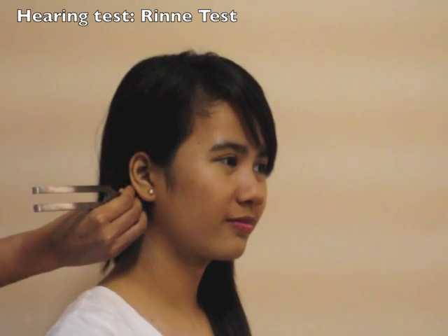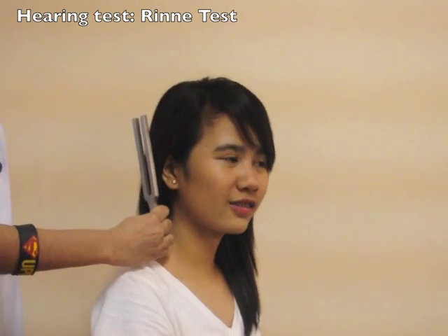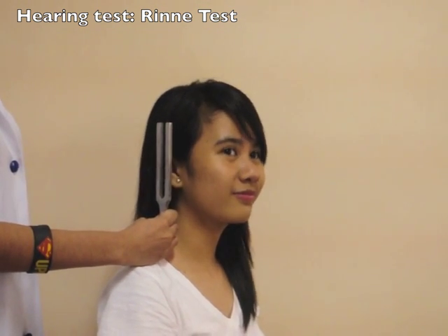Count the time until the patient can no longer hear the sound. Immediately bring the tuning fork in front of the ear. Continue to note the length of time until the patient can no longer hear the sound.